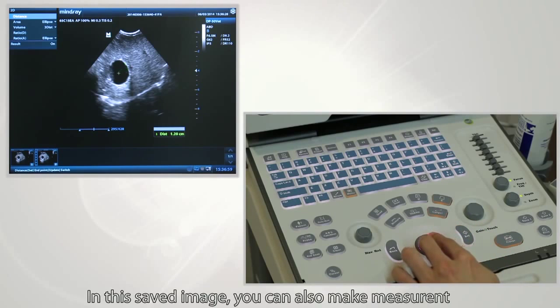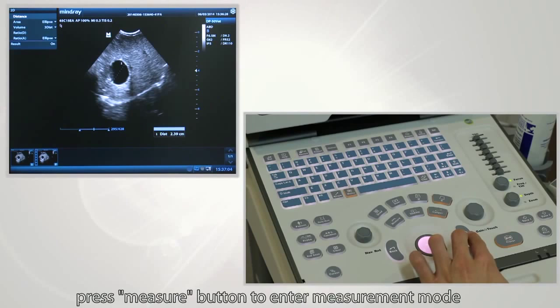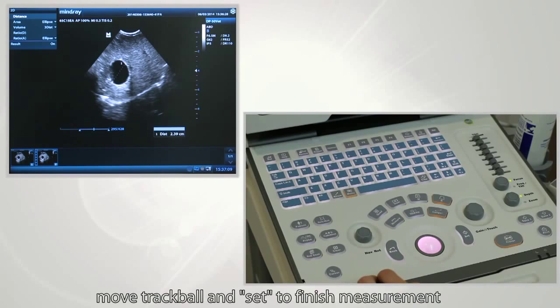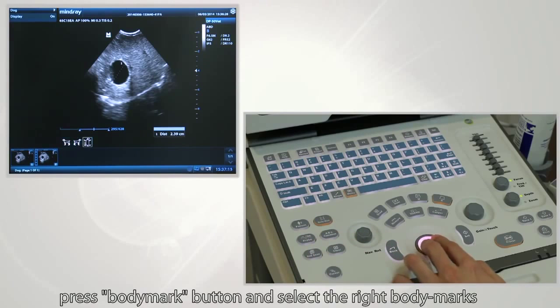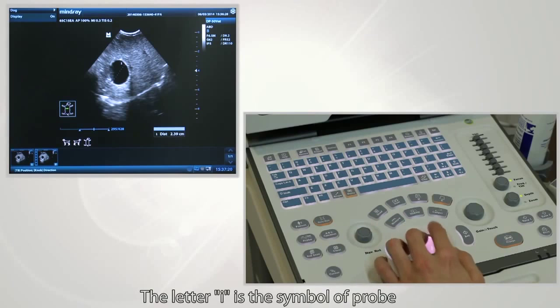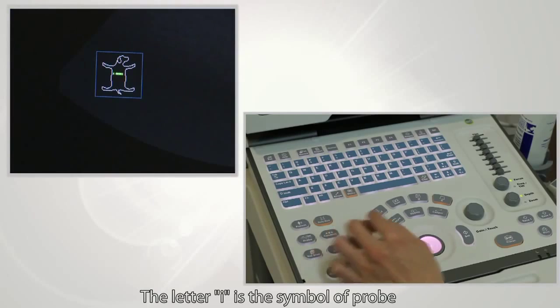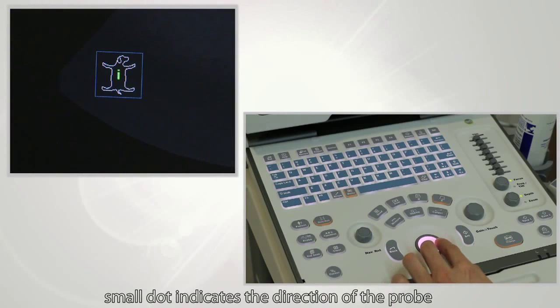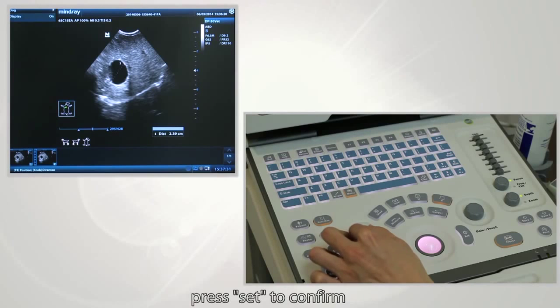In the saved image, you can also make measurements or add body marks and comments. Press the measure button to enter measurement mode, move the trackball, and press Set to finish the measurement. Press the body mark button and select the right body marks. The letter I is a symbol of the probe; the small dot indicates the direction of the probe. Rotate the button to adjust the probe angle, then press Set to confirm.